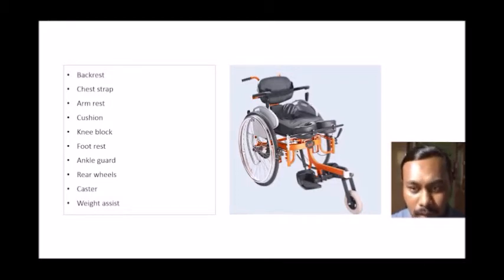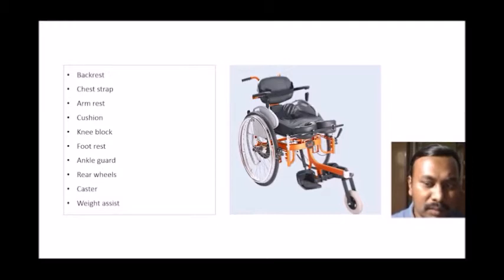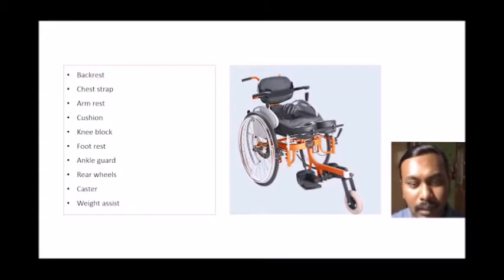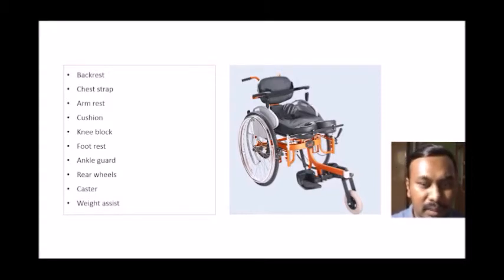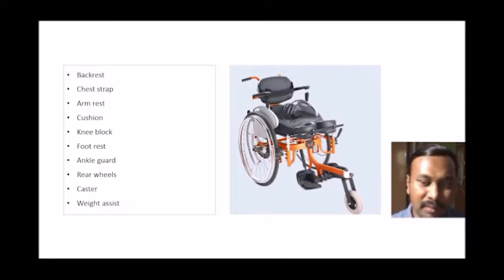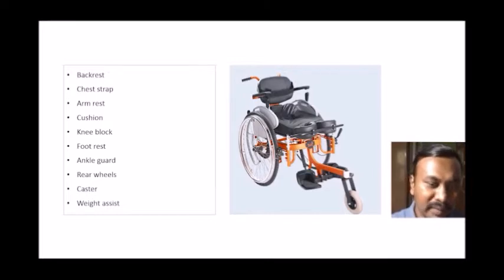There's a backrest, a chest strap for safety, armrests for leaning support, a cushion designed for safe positioning, and a knee block — which is the primary device preventing the person from falling during the standing process. There are also foot supporters that hold the feet securely, and ankle guards that prevent the ankles from sliding front or back. Rear wheels are used as drive wheels for propulsion.